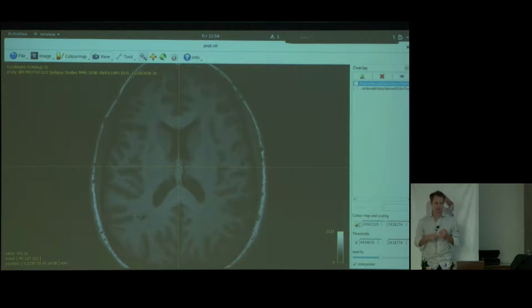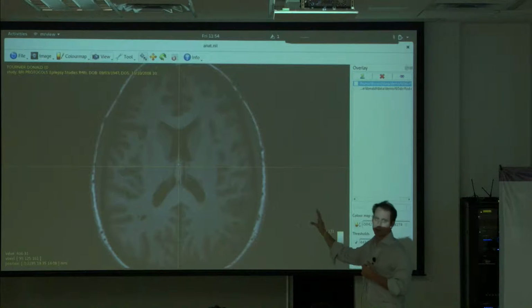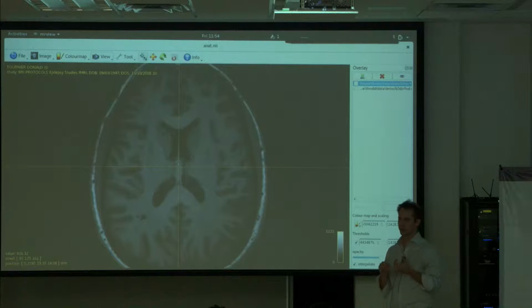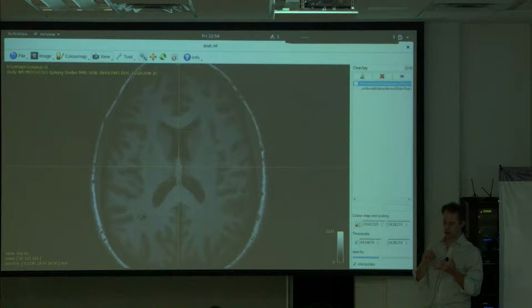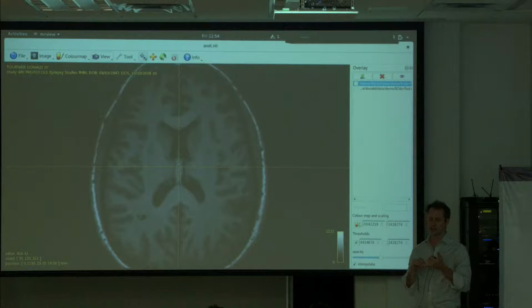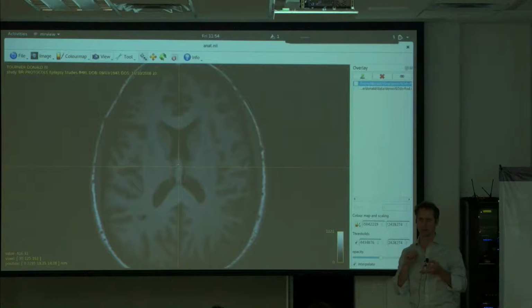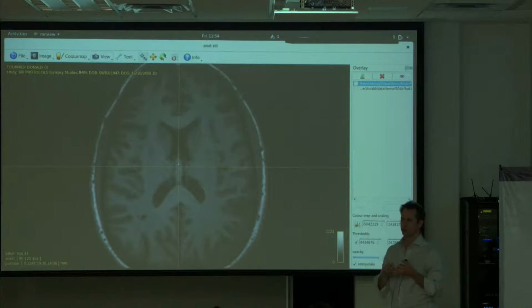Everything else is kind of what you want, apart from the graphics. So if you want to be able to run MRView, especially the volume render thing, which is quite demanding on the hardware, you need a decent graphics card with good OpenGL 3.3 support. There's a lot of considerations there, and I could talk about it all day. The first thing is, if you're running on Linux, the biggest problem is not so much the hardware, it's the software. Your drivers need to be up to date to run OpenGL 3.3.